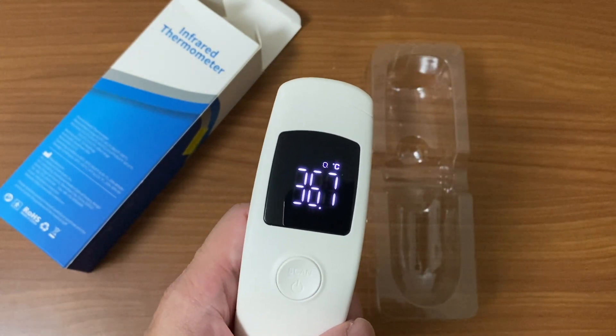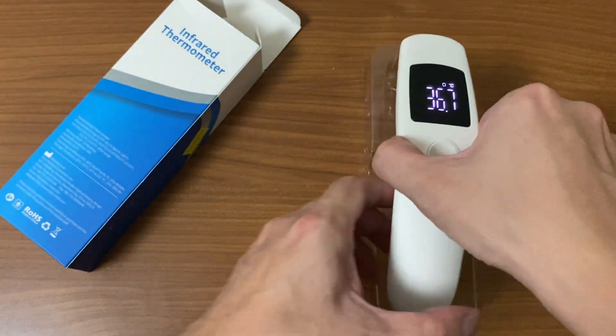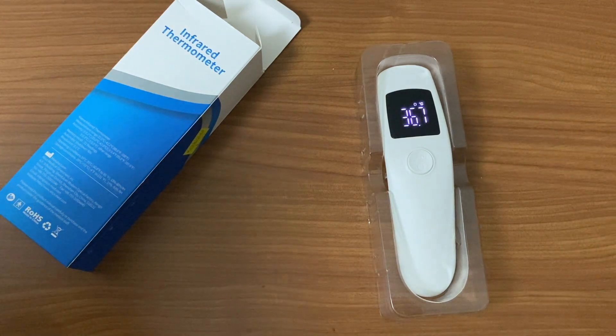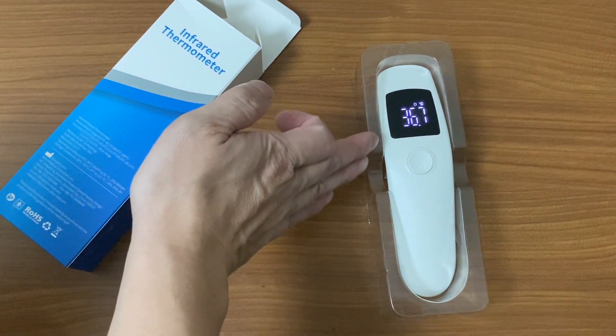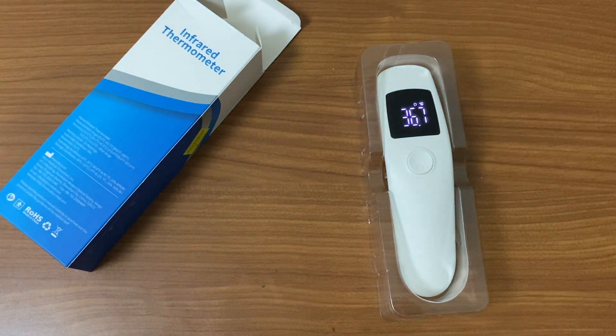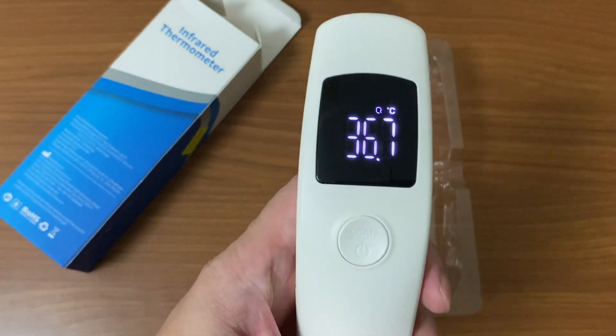For those in different countries wondering what the normal temperature range is: if you use Celsius, normal is 36.5 to 37.5 — as you can see, I'm safe right now. If you use Fahrenheit, normal is 97.7 to 99.5. Anything higher than 37.5 Celsius or 99.5 Fahrenheit is considered a fever and you should see a doctor.